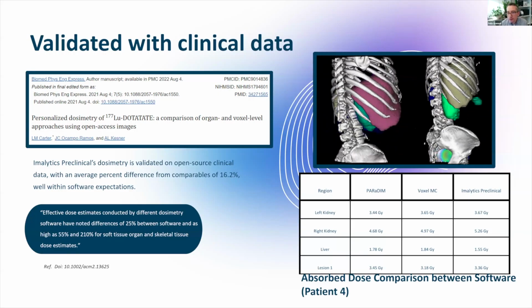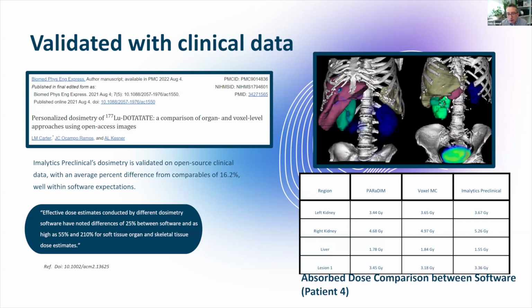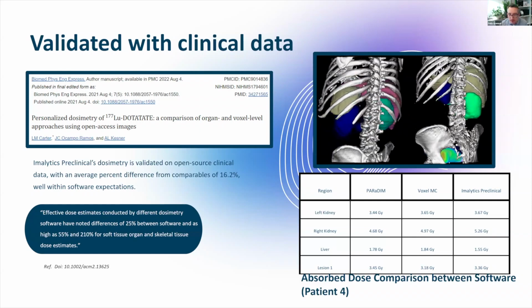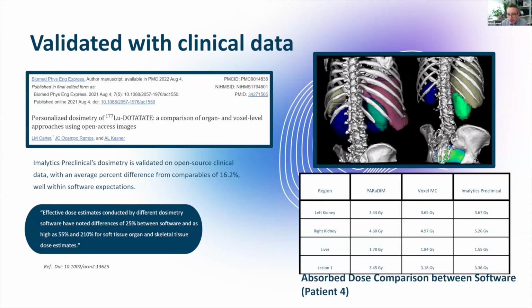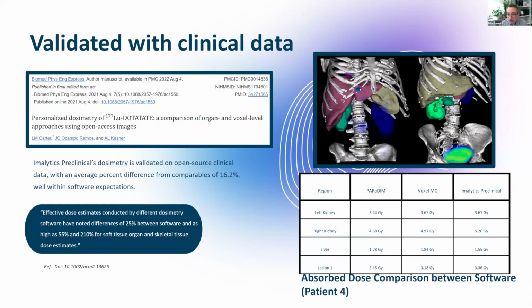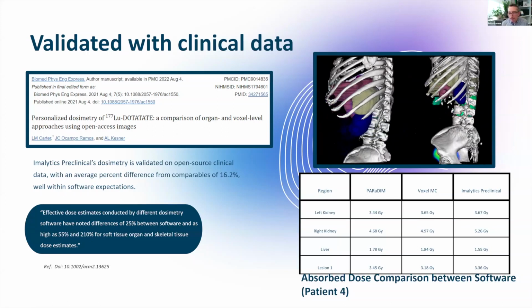And we validated this dosimetry tool actually using clinical data because we found some nice data sets with this publication here. We didn't have that for mice, but our software also works for clinical data. It's just not approved for real diagnostic or therapy planning.